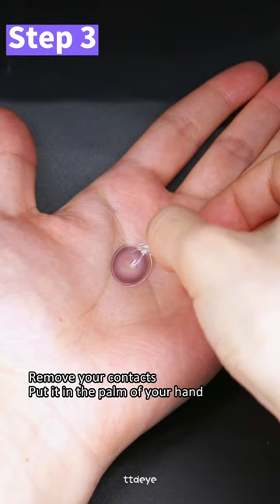Remove your contacts and put them in the palm of your hand. Use the solution and rub the lens for 20 seconds. Don't rub too hard.